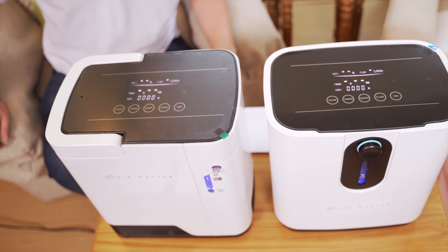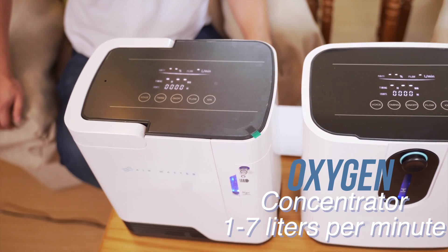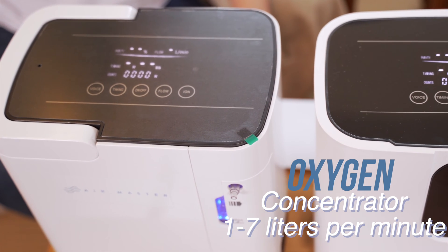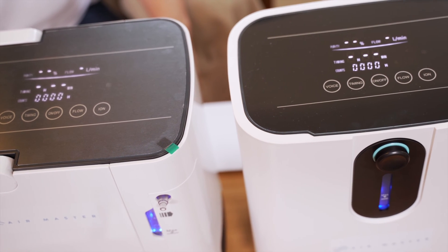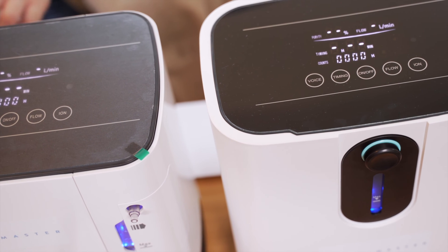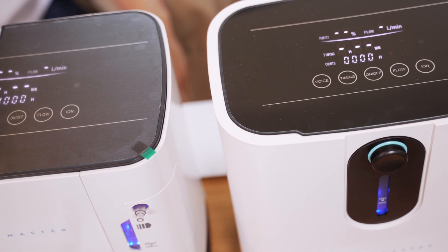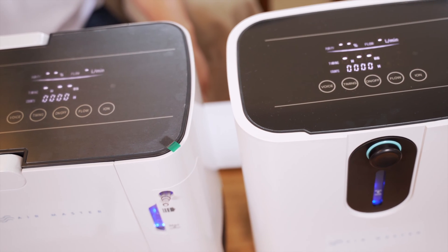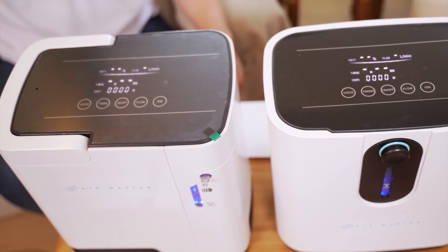Right now, here in front of us, we have the oxygen concentrator, 1 to 7 liters per minute. It's a portable oxygen concentrator. It's good for your homes, and during these times right now, this is important to have. We can also use this in our clinics and offices. In cases of emergency, it's readily available for the use of your patients and your employees.